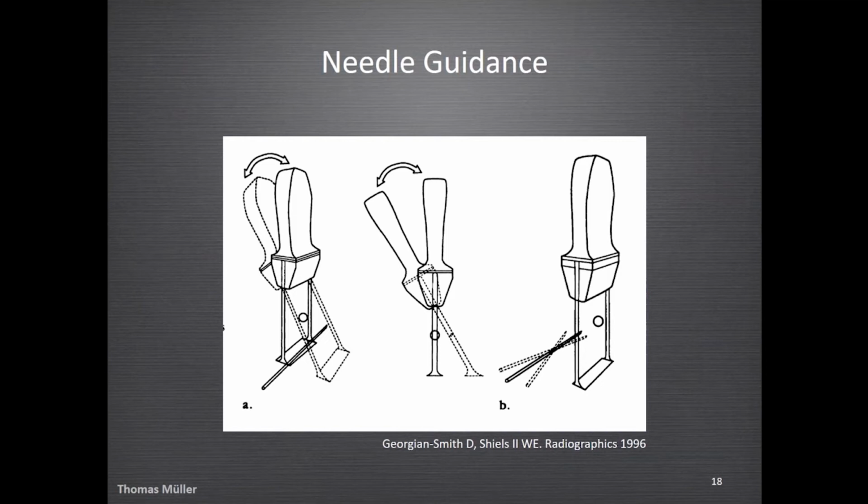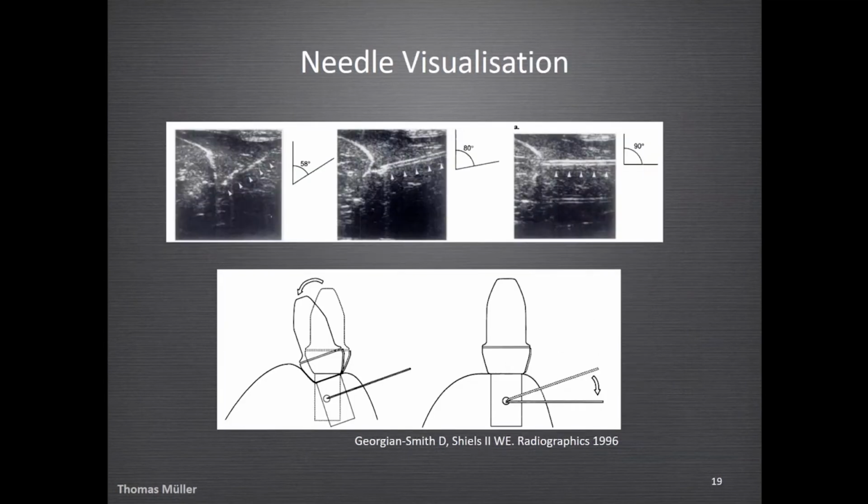You will get used to it. If you can close your shoelaces, you will be able to do freehand biopsy too. This is an old publication from '96. It's 25 years of age, and at this time gynecologists and radiologists made up their mind on how to perform breast cancer biopsies at best.